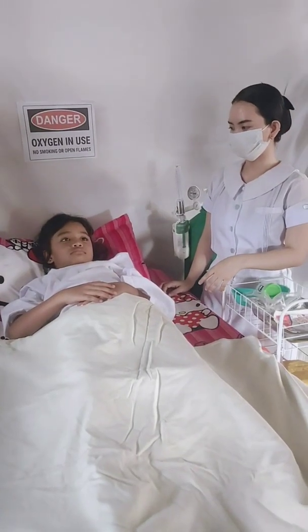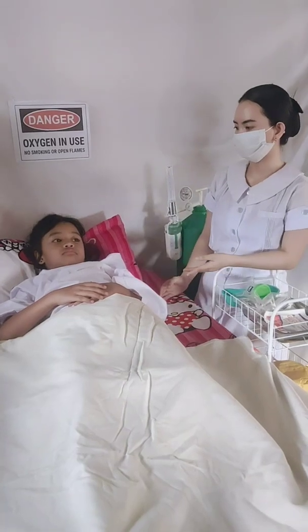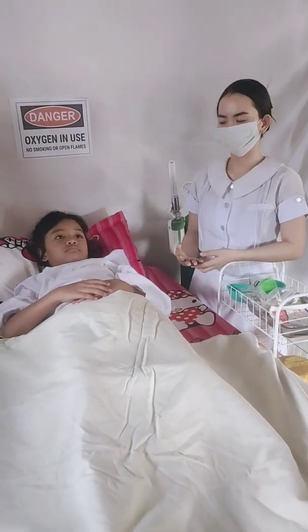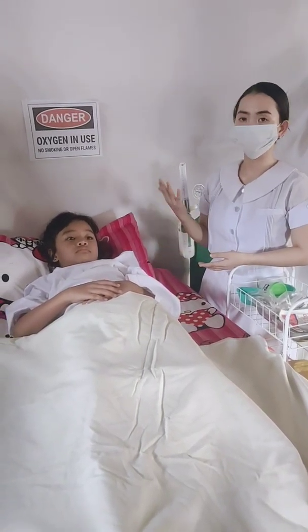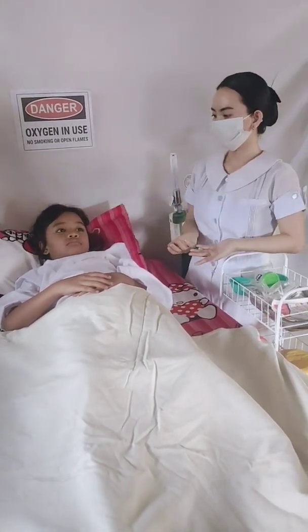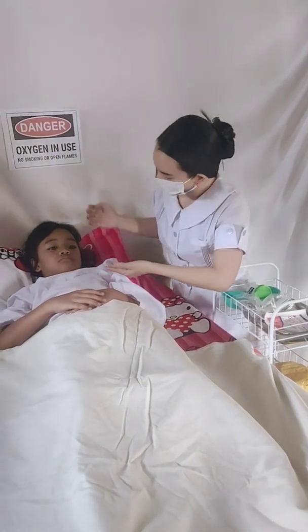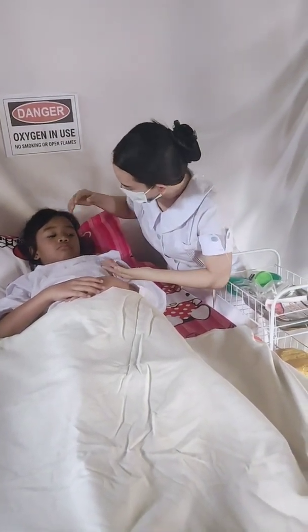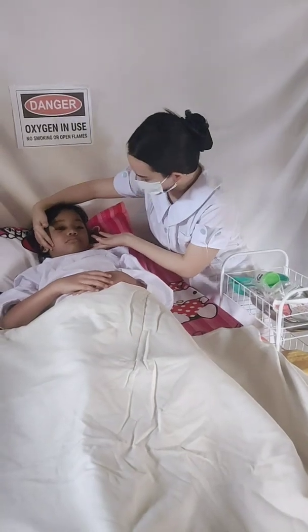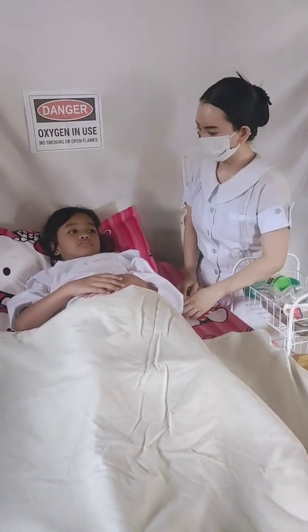Our goal is that the patient exhibits an oxygen saturation level within acceptable parameters. For the assessment, observe for signs and symptoms associated with hypoxia, such as cyanosis, breathing pattern, chest movements, lung sounds, apprehension, and decreased level of consciousness. This is to check if the patient is suffering from hypoxia.